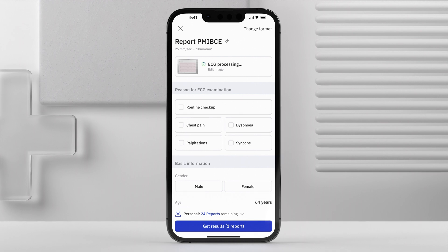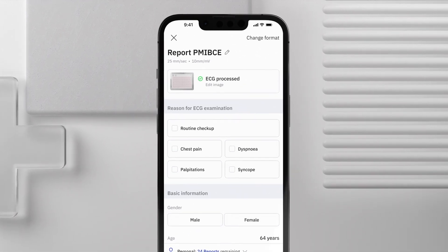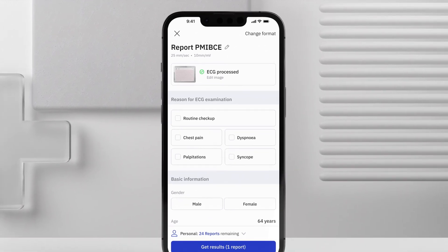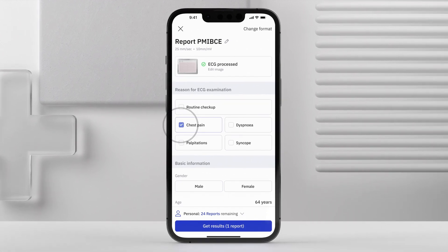Now your ECG is ready to be digitized and diagnosed. Continue to fill in the reason for the ECG examination and basic patient information. Tap Get Results to get the diagnostic report.